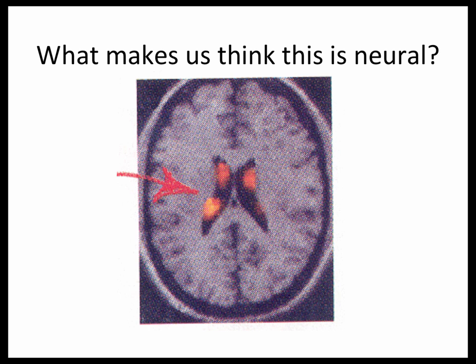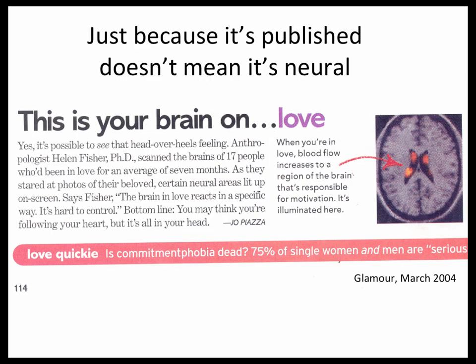But it's always good to remember, even when you see things like this, that doesn't mean this doesn't get out there. So this is one of my favorite publications ever in a Glamour journal, where the study was studying romantic attachment when you look at people that you love versus you don't love. And this is the map they produced of where the activity is when this happens. So either Descartes was right and the ventricles are the seat of your soul, or they published a very nice motion artifact. I always look for excuses to put this picture in because it's a really fun one.